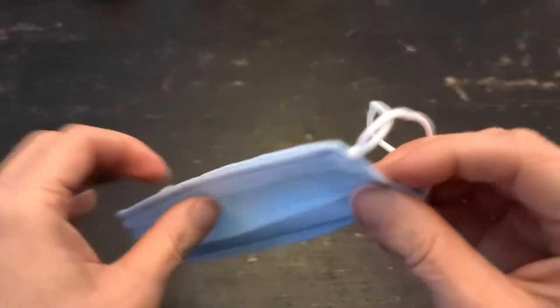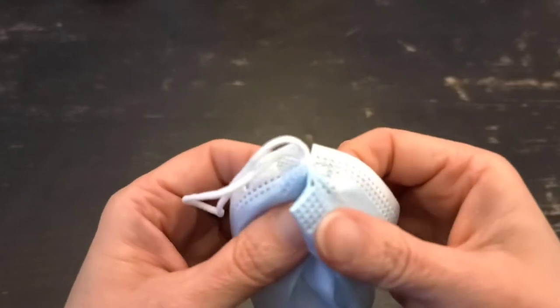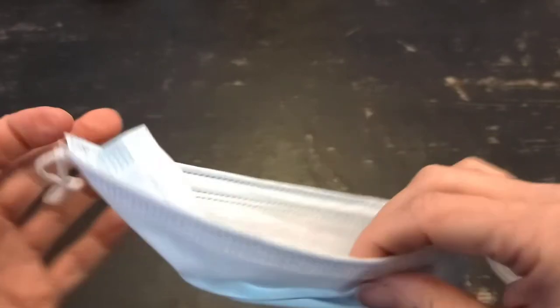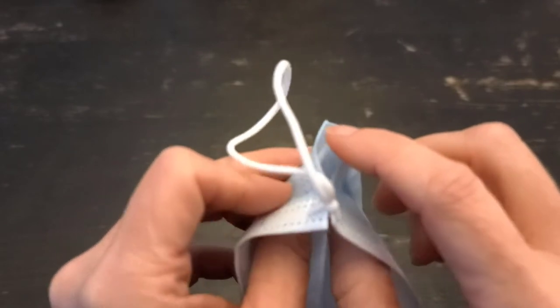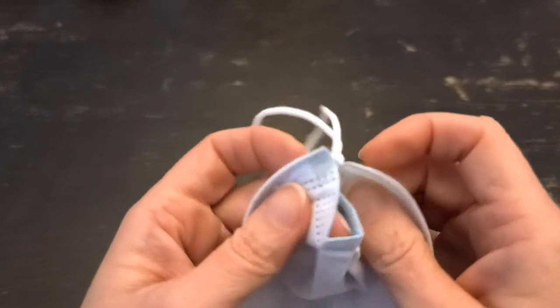Now what we're going to do is take this extra fabric and just put it inside. Here's the inside part that goes towards your face — we've got this extra fabric with this gap here, so I'm just going to put that inside.